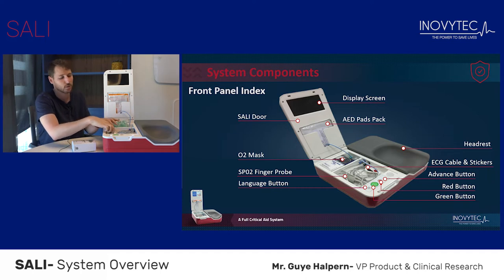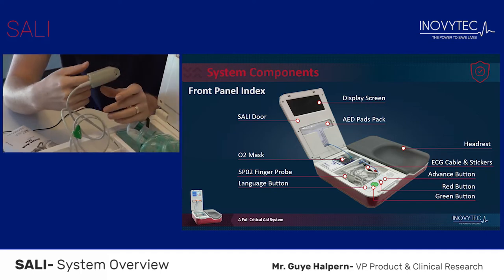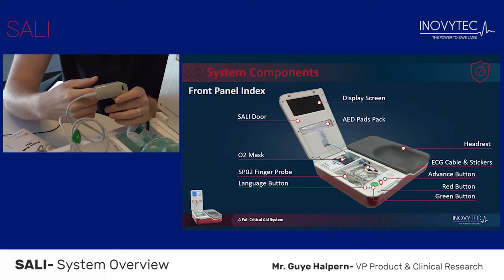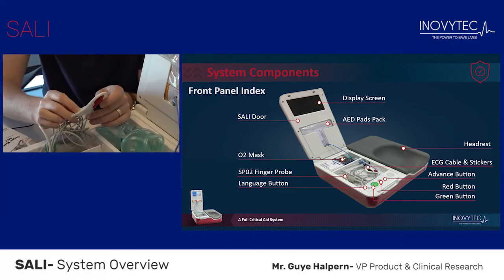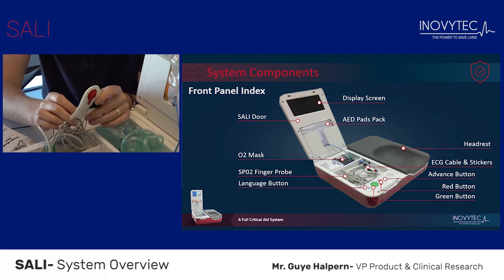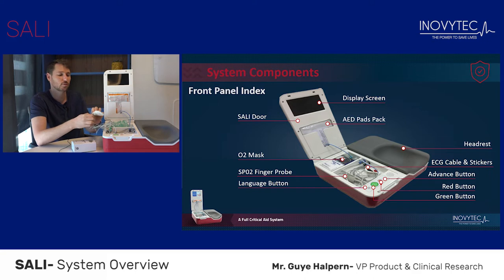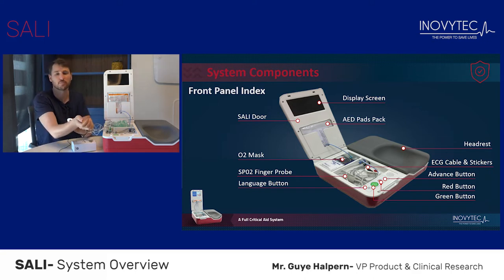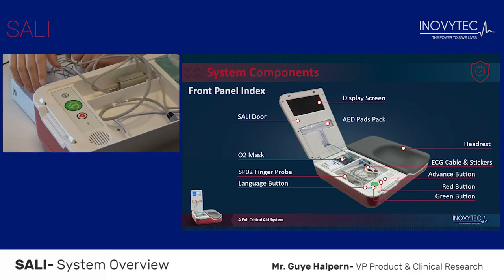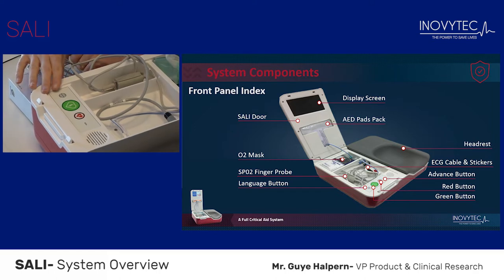Next, we have the SpO2 finger probe, which will monitor the patient's saturation levels. Here we have the ECG stickers — they will help you monitor the patient's ECG without having to undress the patient, by simply attaching both stickers to the wrists of the patient. At the bottom part of the device, you will find the SALI keypad.